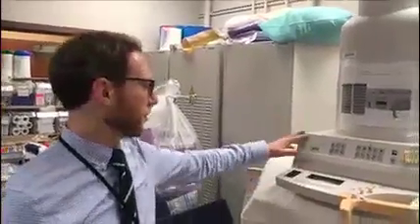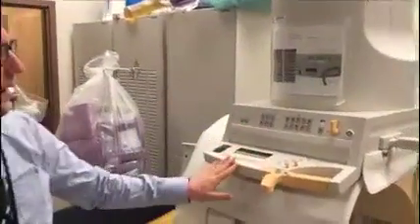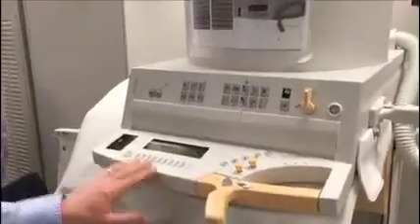Some people advocate for having a fluoro tech turn on and off your fluoro, and if you're going to do that, then you're going to be using closed loop communication with your fluoro tech, which may also help decrease fluoro time.